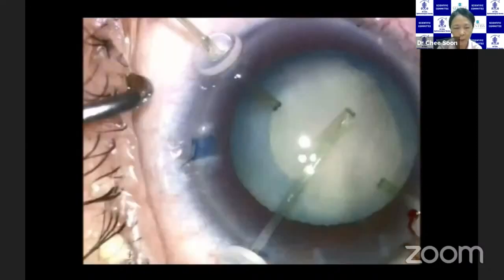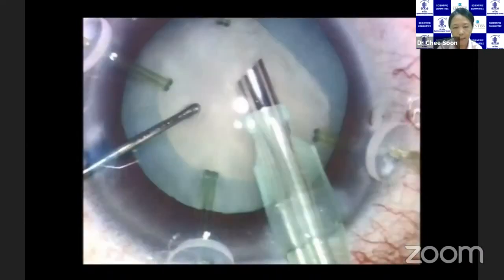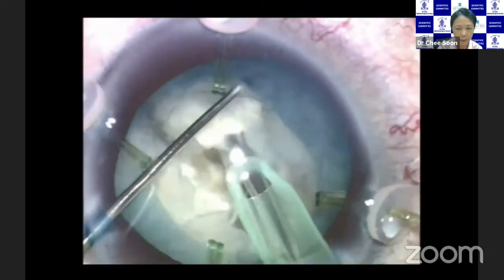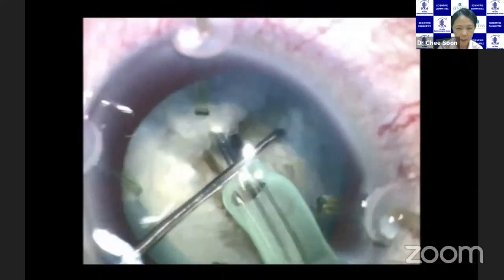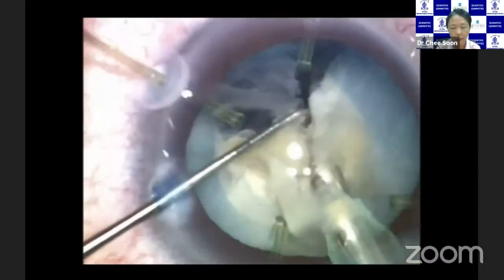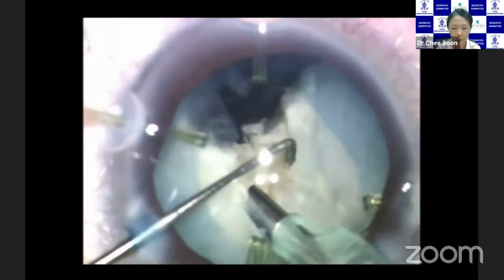Okay, now I know my equator is kept expanded. I put in the capsule hooks that provide further support, and then you can crack right through. All right, it's a little leathery, although this is white on the surface. And you can try to minimize your rotation, and this is how I like to take it out. And you see that in all the surgeries that I do with this, I do it in a very similar manner. Chopping, sometimes you can't rotate. You impale to rotate the nucleus, all right?